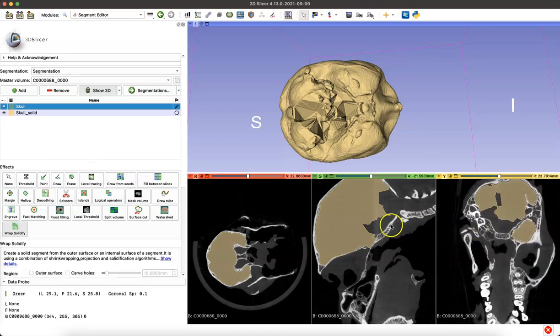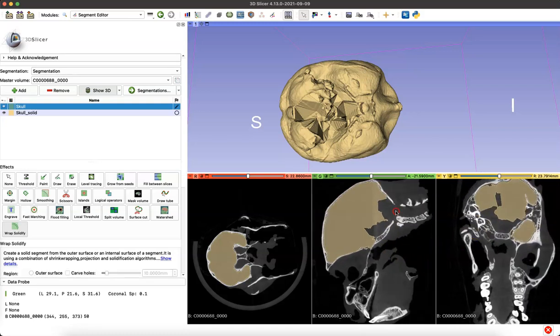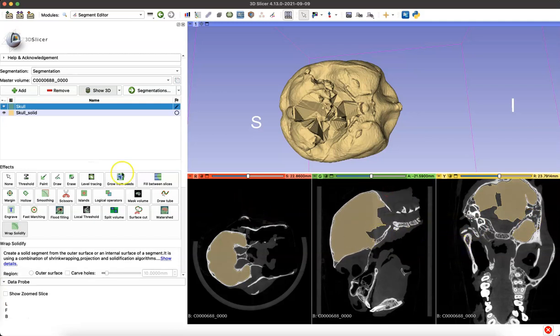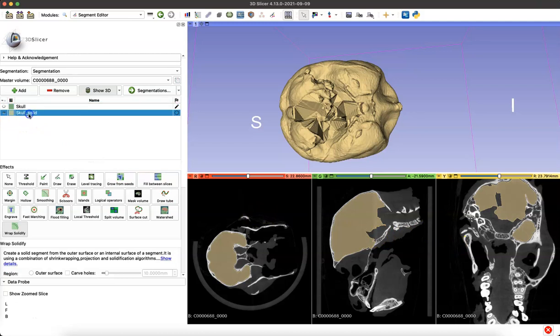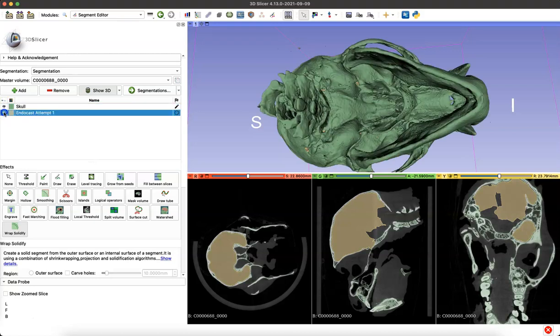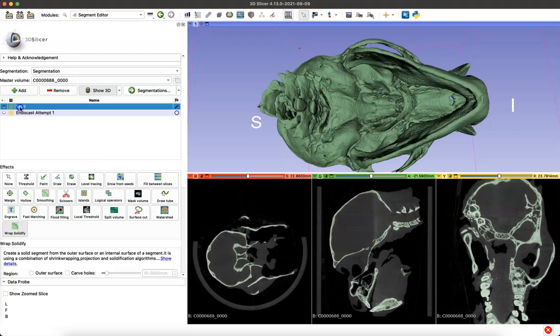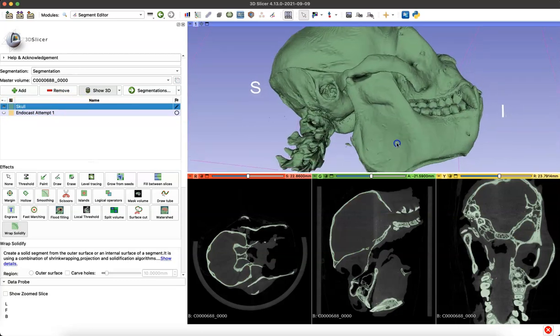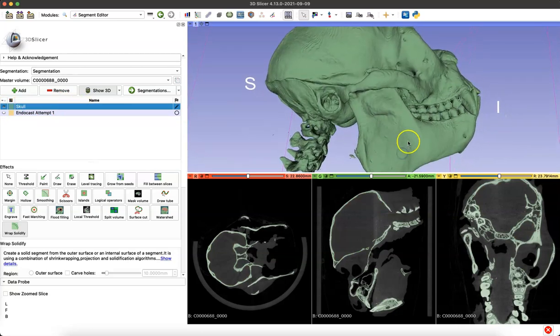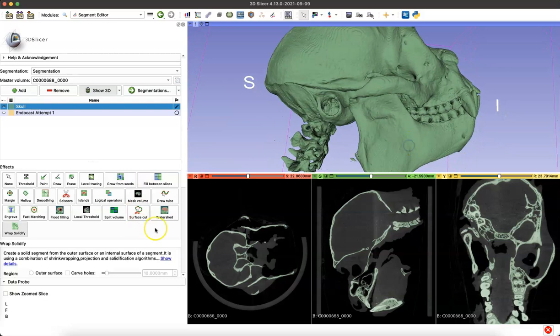We can quickly fix this by just segmenting our skull model a little further, and then we'll run the WrapSolidify program again. So I'm going to rename our endocast attempt, and we'll now navigate back to our skull model. I make sure that I've selected the green skull model so I won't be editing the endocast attempt.